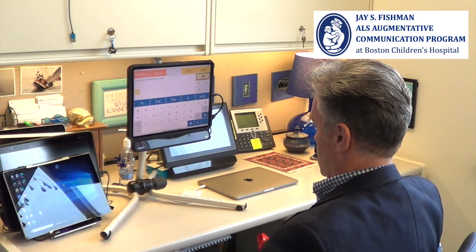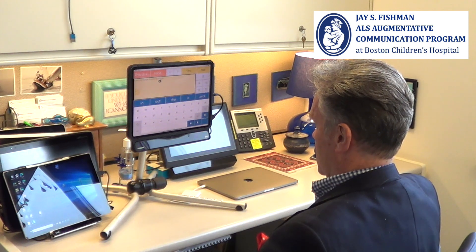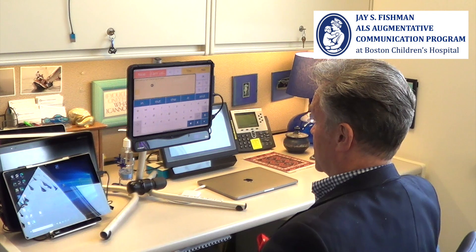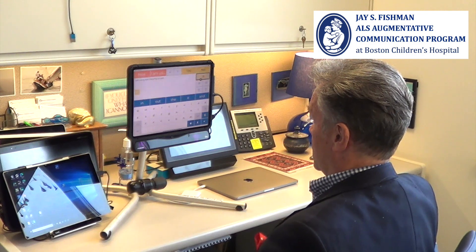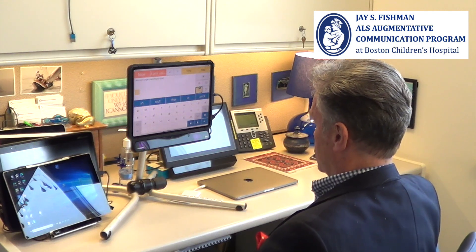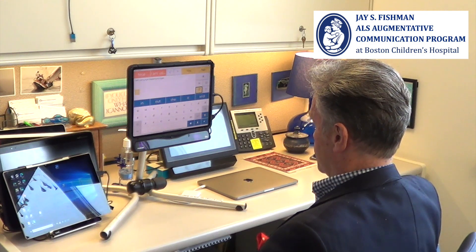I am using eye tracking to type. Okay, I'm now going to clear that.